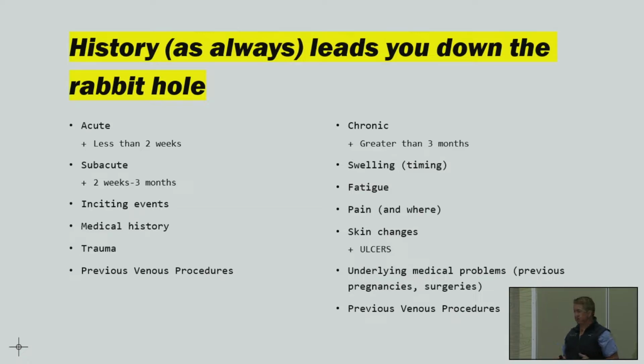There are new devices that allow us to go after things in the subacute phase. And that's incredibly important too, because even if they don't get to you until that 2 week to 3 month period, you can still make a difference in their thing.